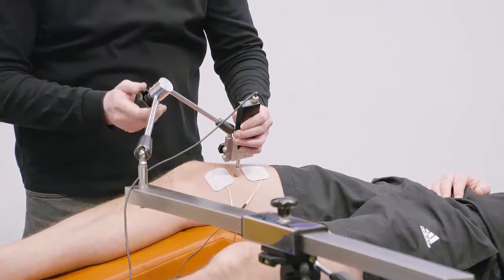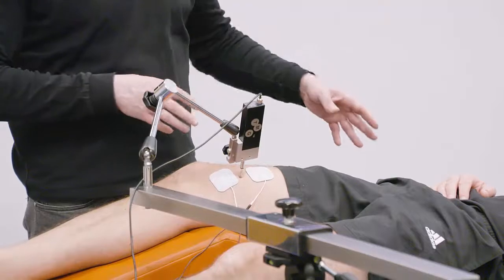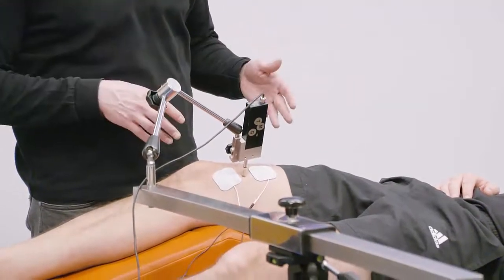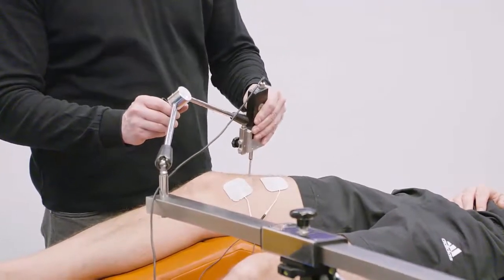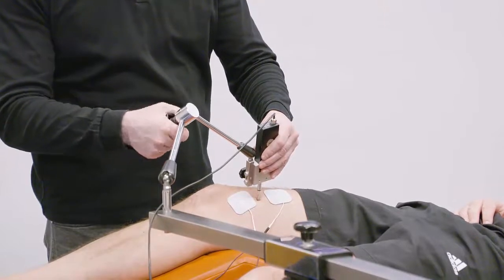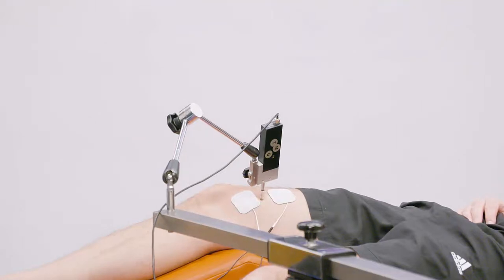Once you position the sensor, ask the subject not to move. A small movement doesn't affect everything, but a big movement could cause the sensor to go to a completely different position and obviously affect the result. Once you position this, you are ready to begin with the measurement.